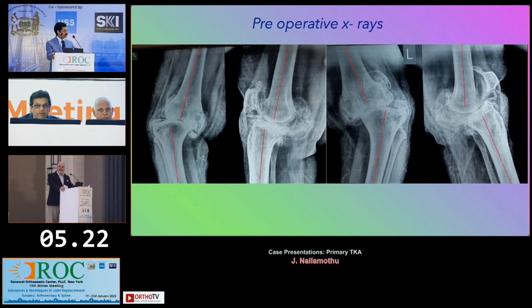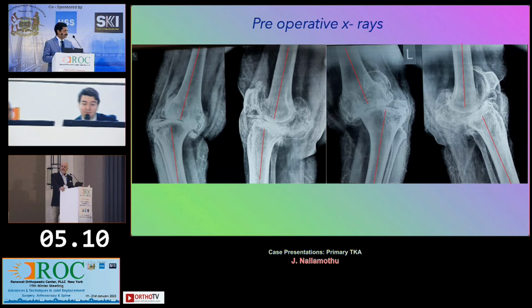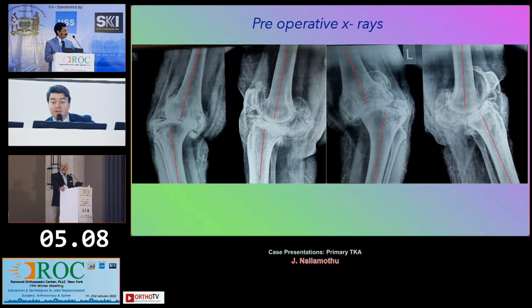Anybody worried about neurovascular structures? I would let the vascular team know you're doing this case, so you want them on call in case you get into trouble back there. A lot of this is hyperextension, so you have to be careful. Once you remove that massive osteophyte, you're going to get into more trouble, with potentially a massive amount of recurvatum. So having revision implants with distal augments available would be helpful.